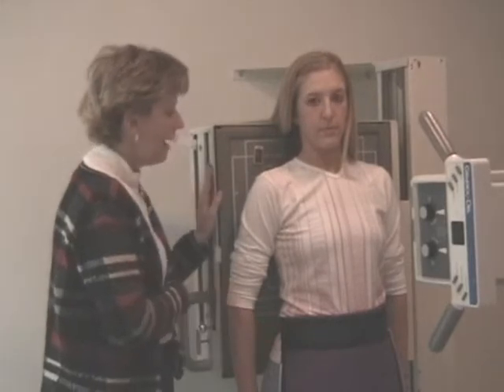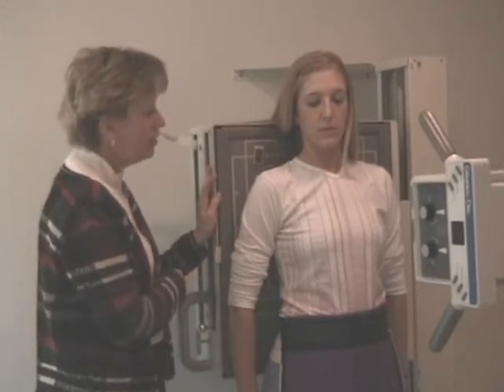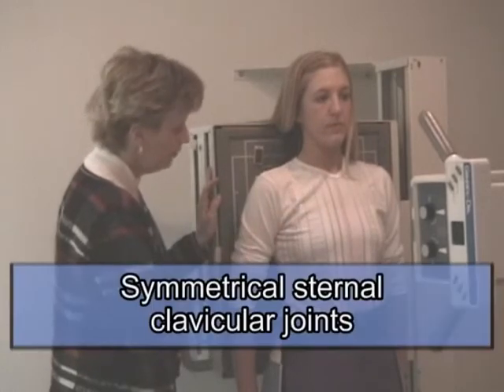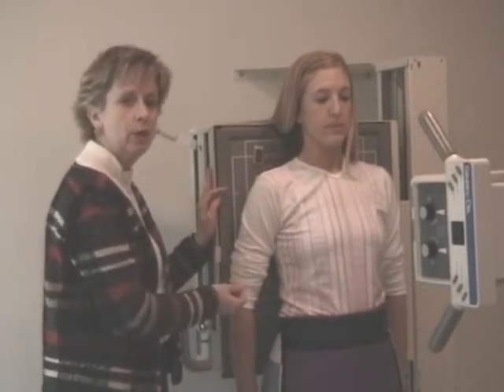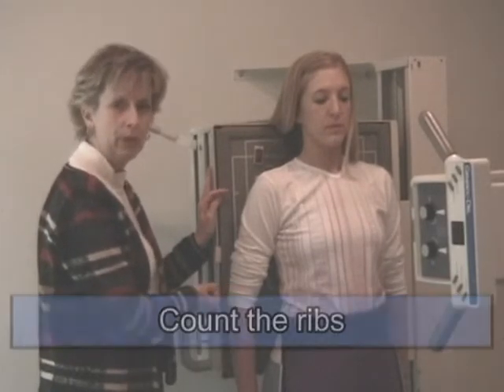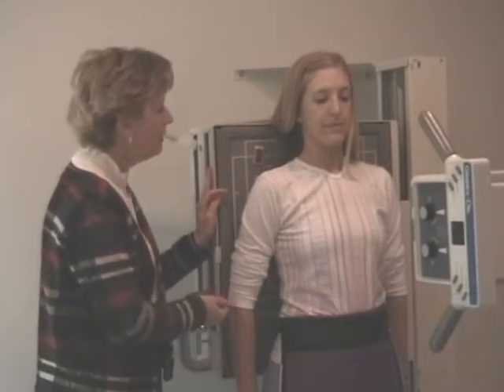So we've just now done an AP for posterior rib injuries on the right side with deep inspiration. If she's in a true AP position, the sternoclavicular joints will be symmetrical. And we will want you to be able to count your ribs. I want you to be able to recognize whether it was exposed on inspiration or expiration. So when we do film critiques, make sure you count the ribs, know that the diaphragm should be below the 10th posterior rib with a good deep inspiration. So we can let our patient relax for a minute.